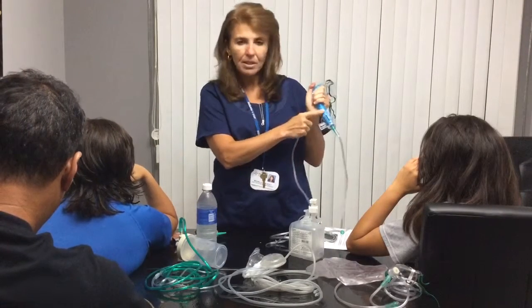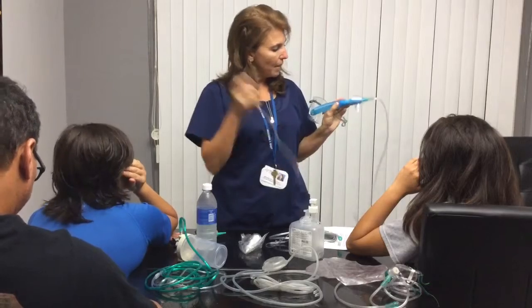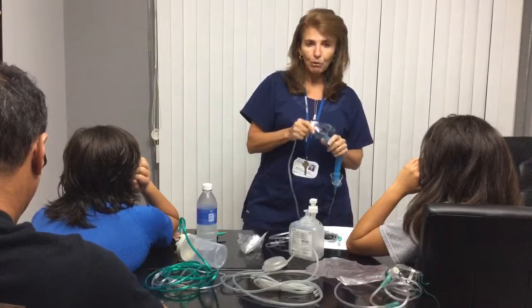For example, this system goes from 24 to 50% based on the different adapters that we have. We would set that up and then set your flow accordingly. This is the only type of mask that you would actually use a lower flow.